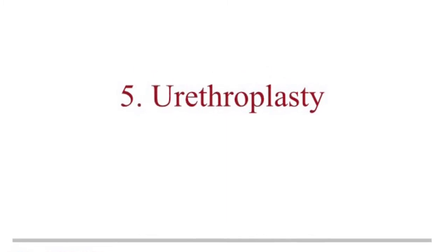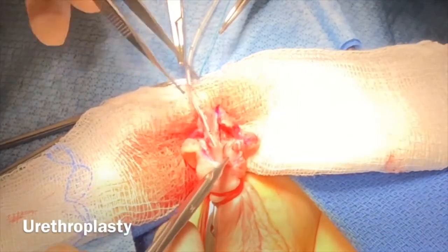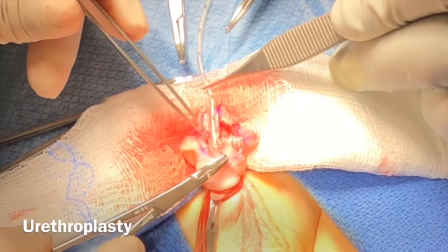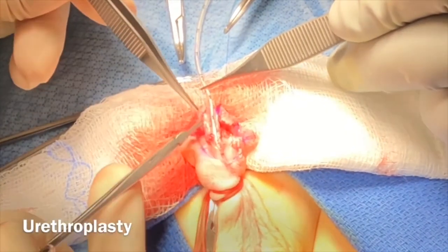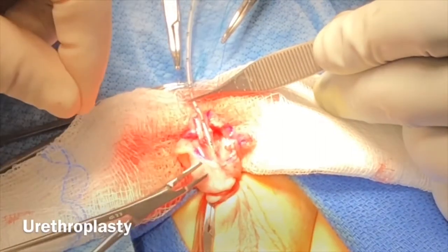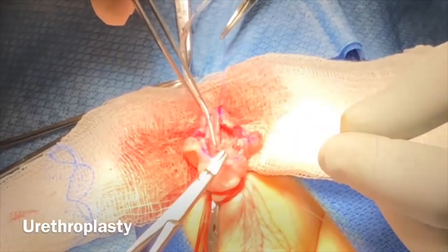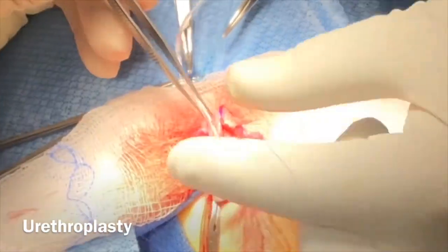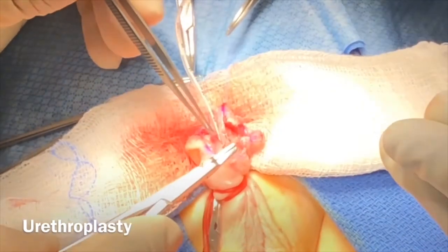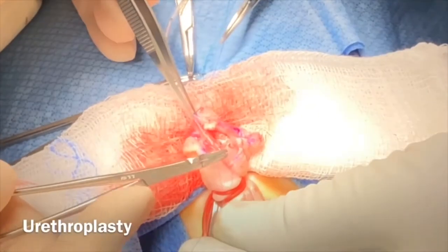We perform the neo-urethra formation using a 6-0 PDS suture, single layer, subcuticular fashion. The suturing is very parallel to the urethra, which includes a nice submucosal tissue. As the urethroplasty is advanced distally, it is very important not to advance too distally or tighten it too tight, which can cause a fistula due to obstruction.